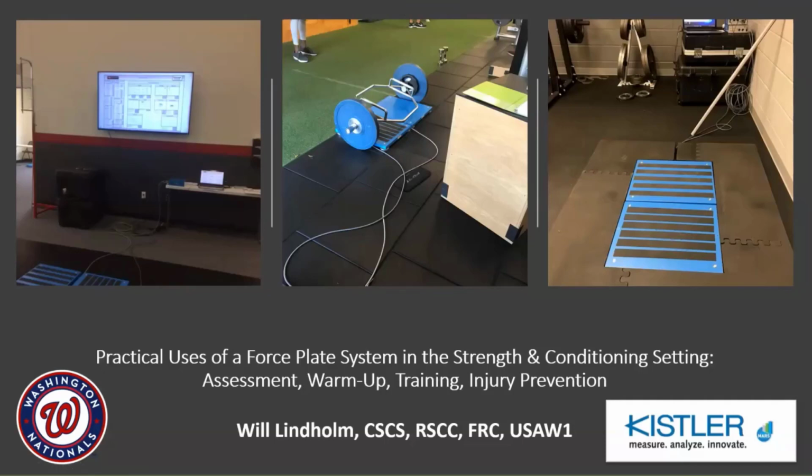What I'm going to do is go over practical uses of force plates in the setting that I work in, which is not necessarily a laboratory, and how we can apply that information directly to our athletes in multiple areas, whether it be sports specificity, helping trainers with a rehab process, strength coaches, and anywhere between.